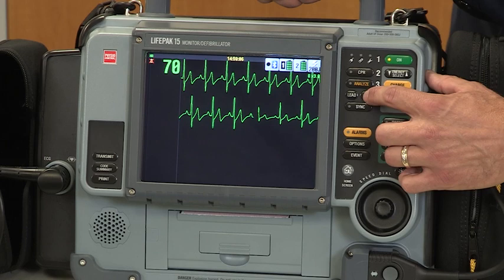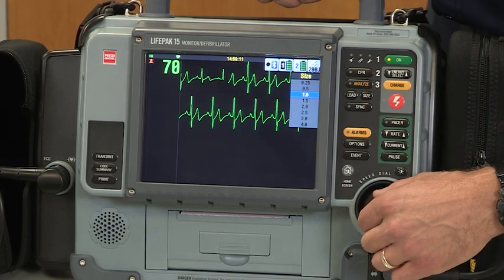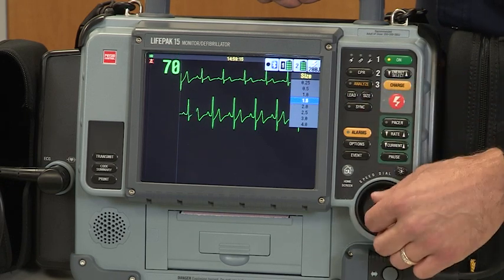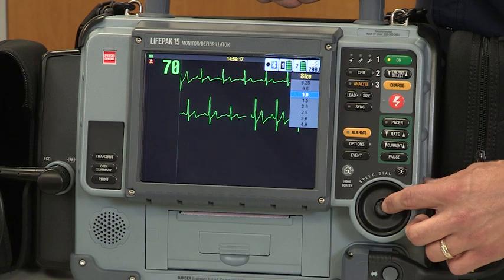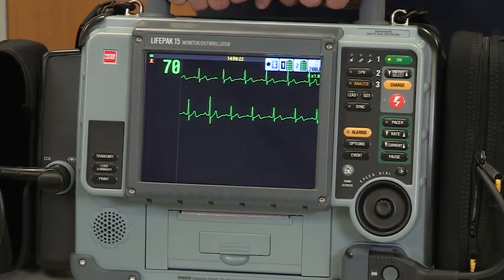If you want to change it back, press the size button, go back to 1.0, which is the default, by the way. Select 1.0, press the button, and it'll return to the original setting.